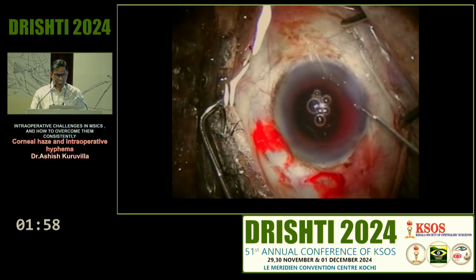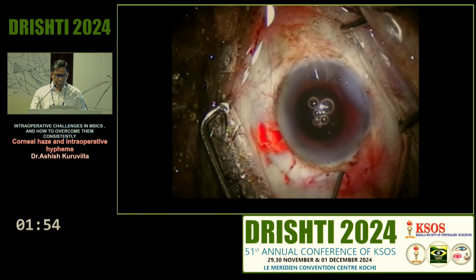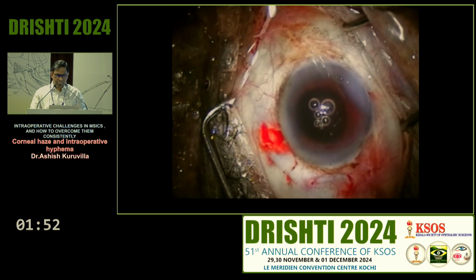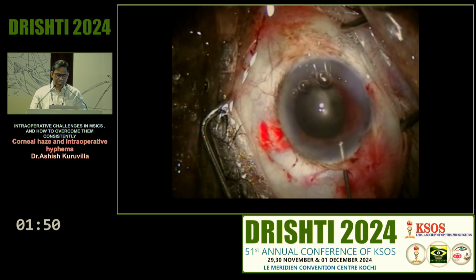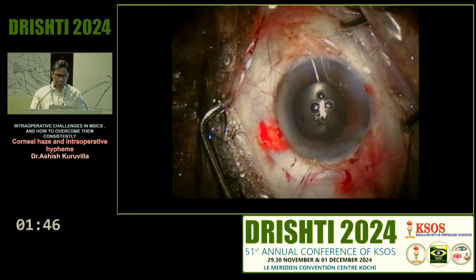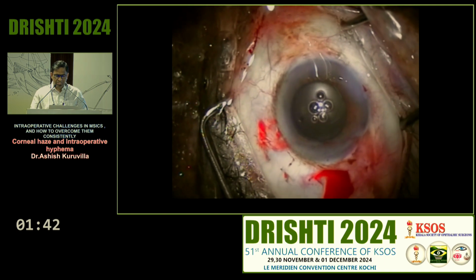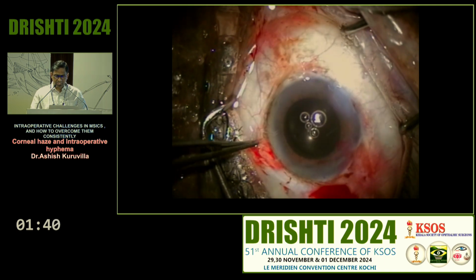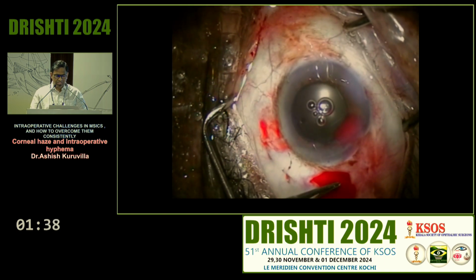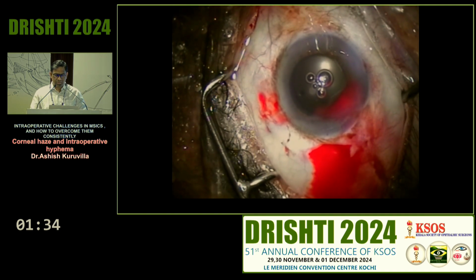more in MSICS as compared to phaco. It is coming from the scleral bed. So basically, the standard thing is keep the eyeball firm. And just doing that itself usually makes the blood clot, and then within 2 to 3 minutes, you're fine, and you can just not do anything else. But if your corneoscleral tunnel is not well constructed, and the corneal lip is not good, then it will leak and go into the eye. So corneal lip has to be very good.